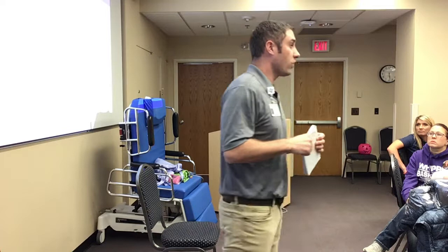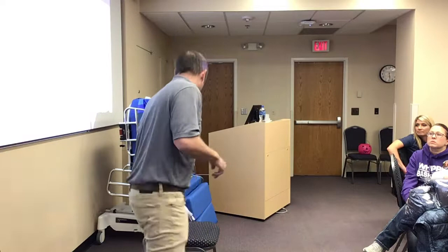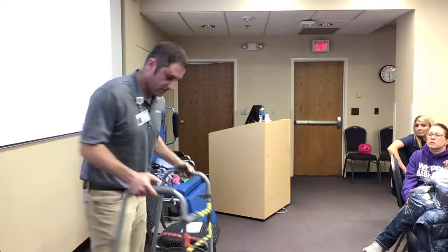If you have patients where you don't know how they move or you're kind of afraid of how they move and therapy is not involved, it's a good idea to get PT and OT involved. So let's talk about assistive devices. The one you're most commonly going to see is a front-wheeled walker.